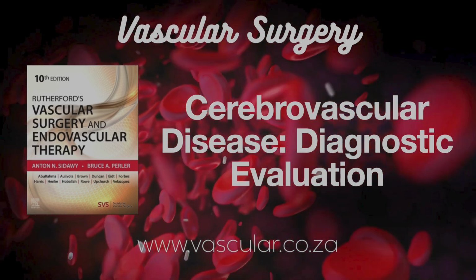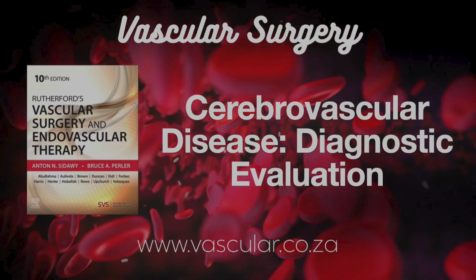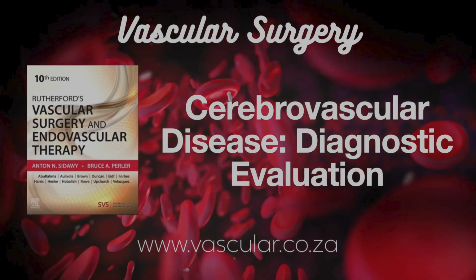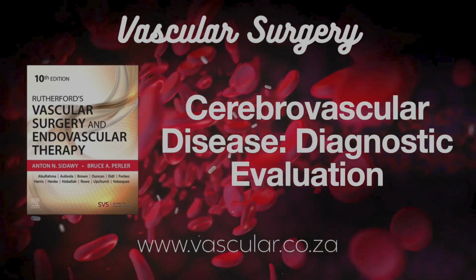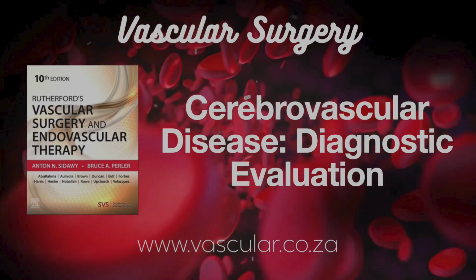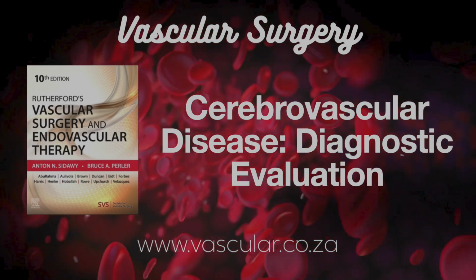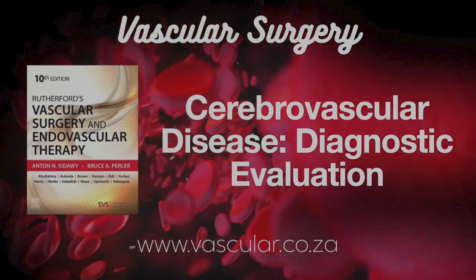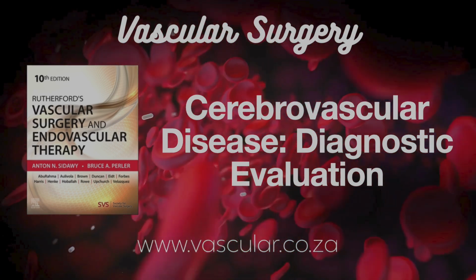Duplex ultrasound simply does not provide enough detail about the aortic arch, the vessel origins, the full length and tortuosity of the carotid, or the brain circulation. So for stenting, either MDCTA or, less commonly, DSA is considered mandatory for preoperative planning. DU alone is insufficient.